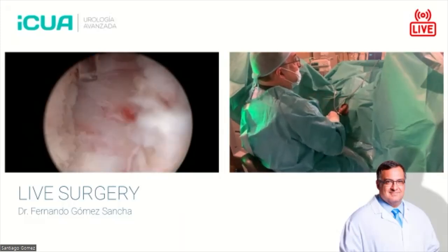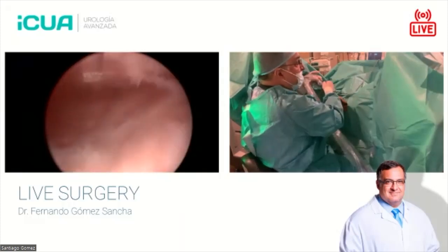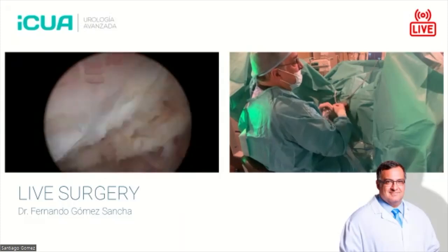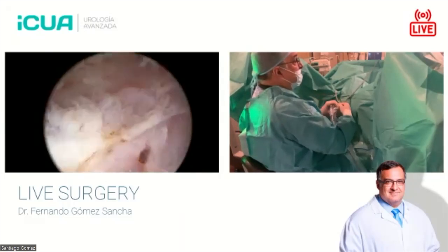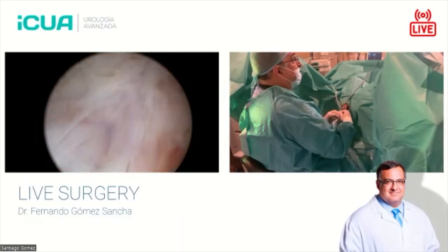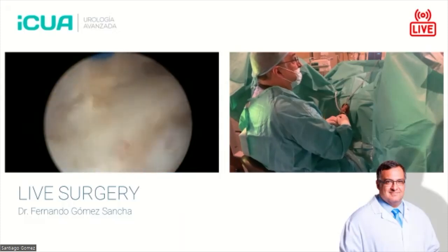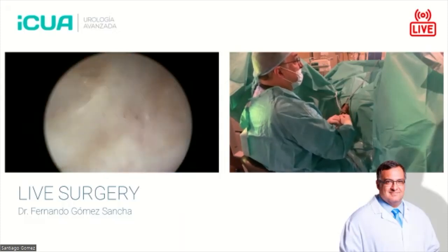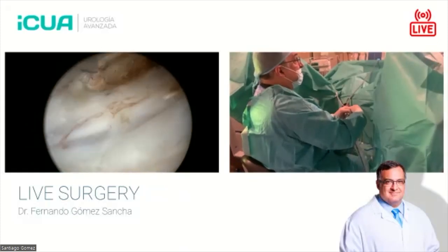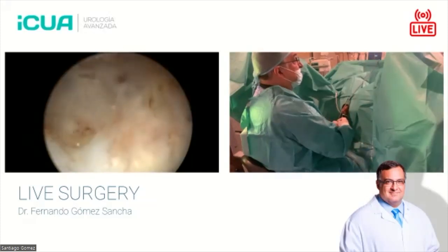Let's go to the other side. When something gets a little bit more difficult, you see the prostate's getting very mobile now. So even maybe I could lift it a little bit. Not yet, I think, but I will try to get under and see if I can finalize or improve the dissection in this side. You see here, we will get towards the bladder neck. This is posterior. Here, coming up, always correcting the aiming of the laser so that it doesn't go against the capsule, it goes against the adenoma on top.